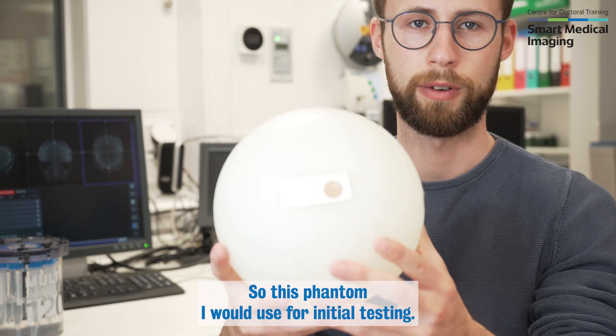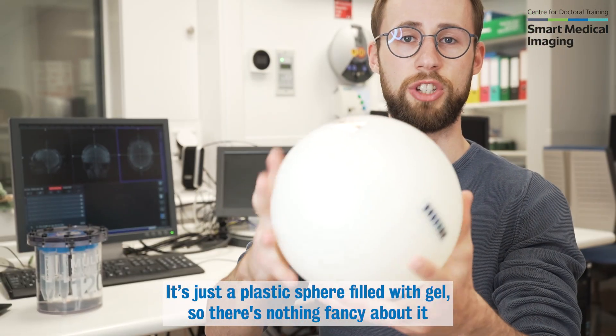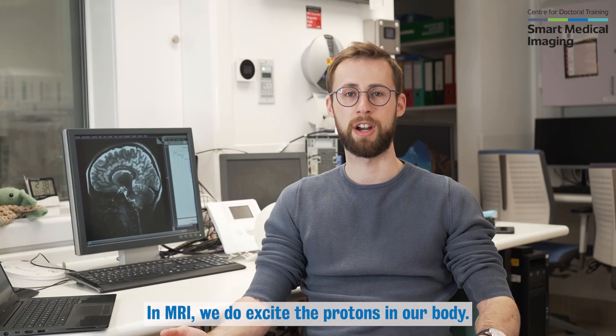So this phantom I would use for initial testing. It's just a plastic sphere filled with gel. There's nothing fancy about it, but on the plus side it's very uniform.